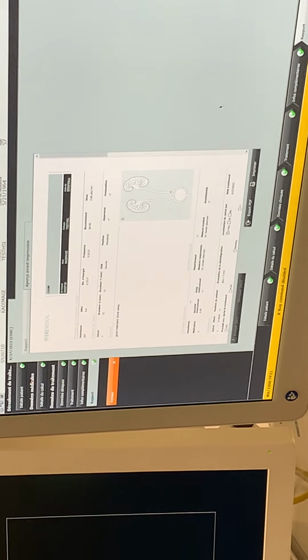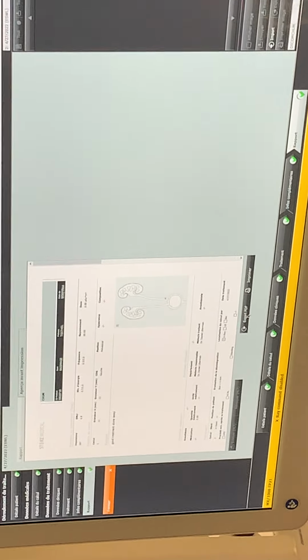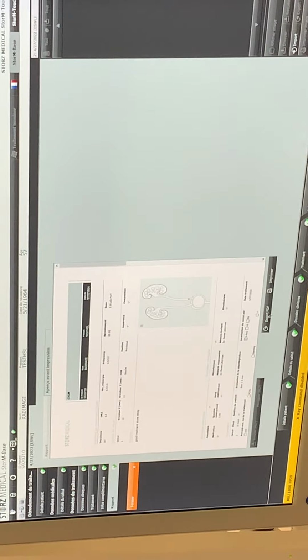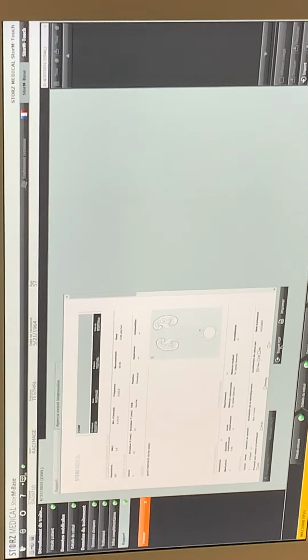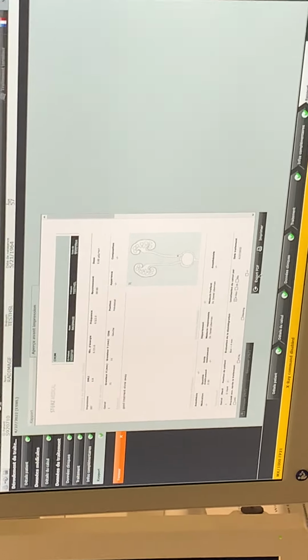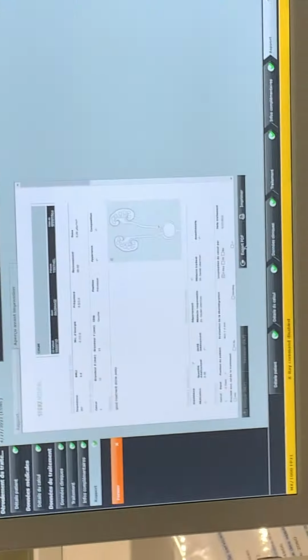Okay, that's fine. You can export it by USB. So if you press here, export USB. Because a document has to be left in the chart. But you need to enter a USB stick here at the hub. At the chart, what do you mean exactly? I mean, for the chart in the hospital, for the referring physician outside. You know, we're having all these patients from all around. He put the document of the patient, exactly. Like we used to do. I need to check. Okay, so that's my point.